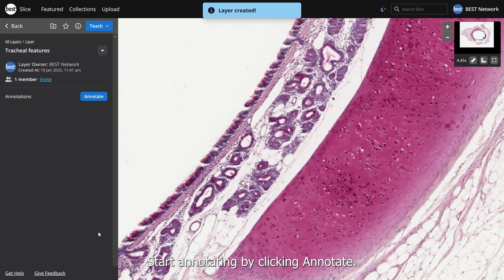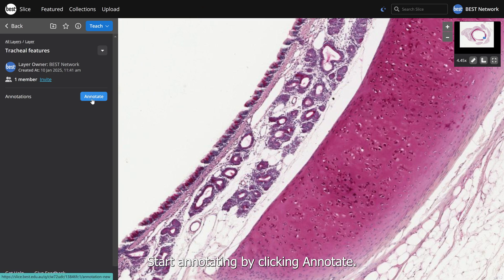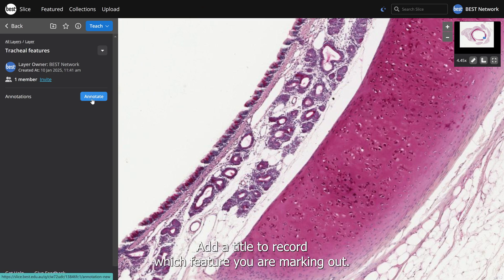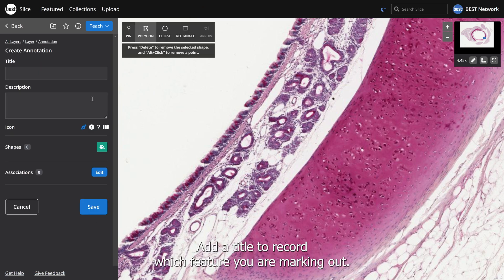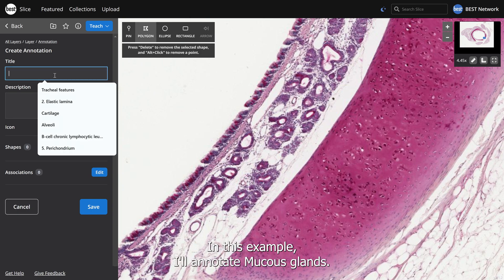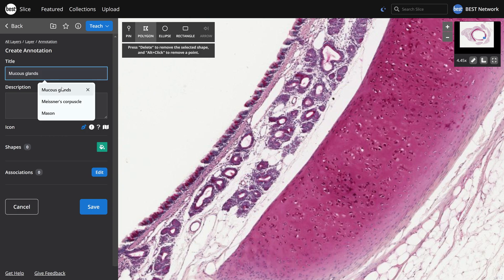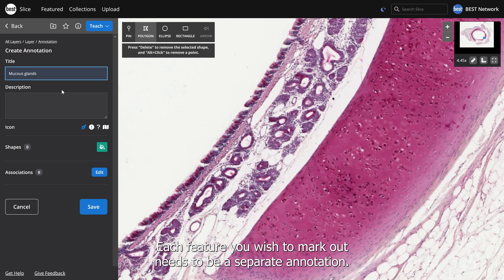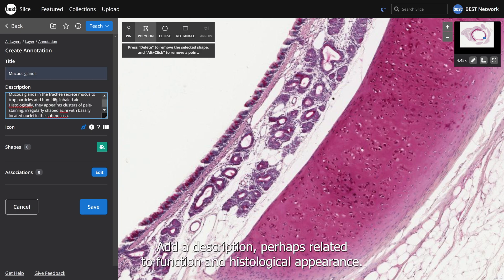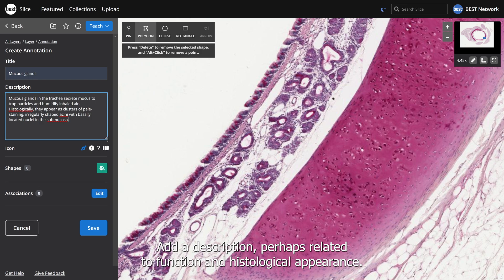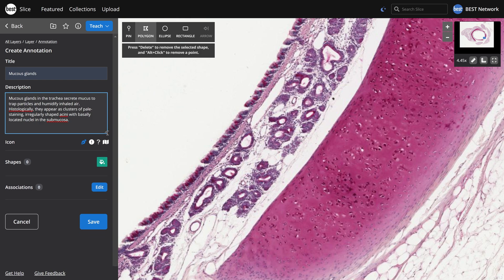Start annotating by clicking Annotate. Add a title to record which feature you are marking out. In this example, I'll annotate mucous glands. Each feature you wish to mark out needs to be a separate annotation. Add a description, perhaps related to function and histological appearance.